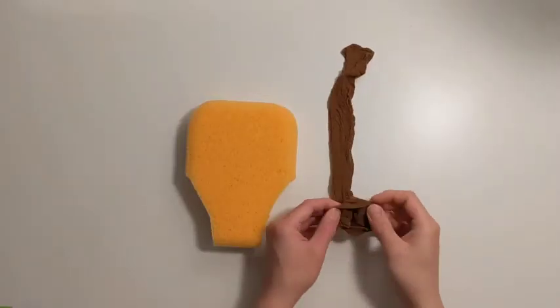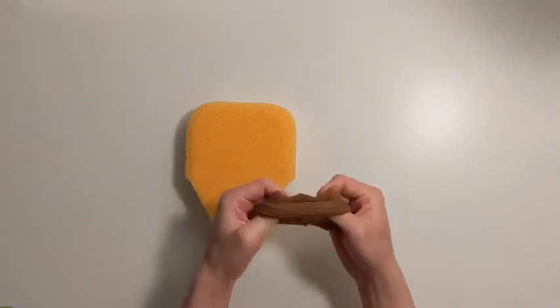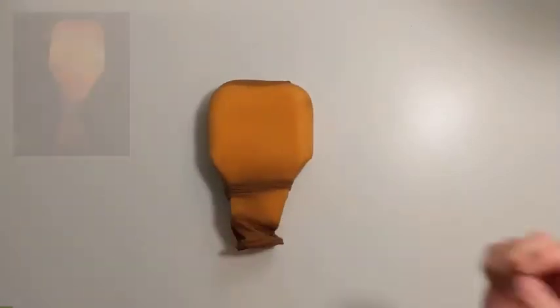Next, we will place the uterus in knee highs. Roll the knee highs up, then unroll them over the untrimmed end of the sponge so that the opening of the knee highs is at the inferior portion of the uterus.